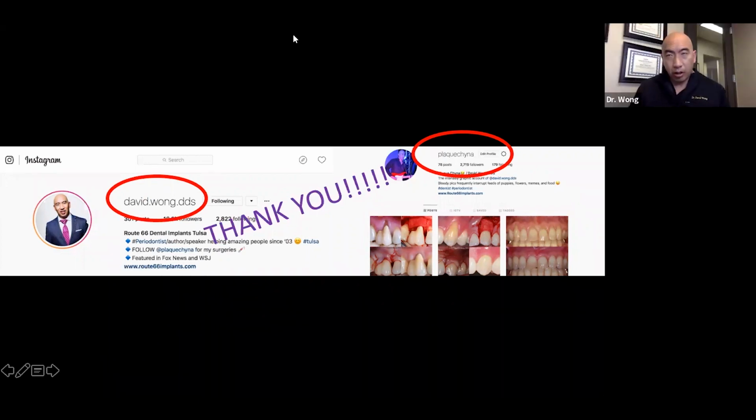Yeah, so the cone part goes in first, right? The cone part goes in first over the labial, basically patching the fenestration. So it actually goes into the socket. Then you graft the material and adapt the ice cream cone part up against the wall and the fenestration. So you're packing that socket. At that point, the only thing you should have left over is the ice cream part, right? And then all you do is fold that over the top.